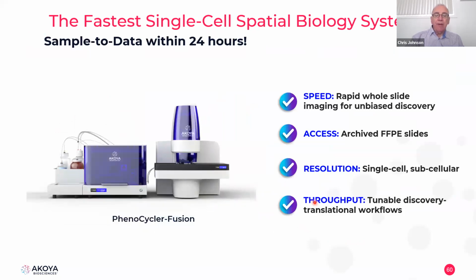The PhenoCycler Fusion is quite rapid. It does these within about 24 hours, a slide within 24 hours. So it's very fast for very, very large amounts of biomarker identification. You can look at both fresh section, frozen and formalin-fixed, or you can look at archive material, which means you can go back and look at old patient blocks.